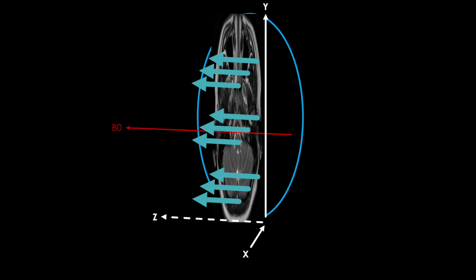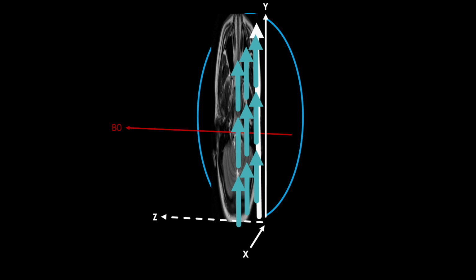Let's quickly return to the visual from the previous lecture and examine this further. Here we have all of our little magnets aligned with the z-axis, the B0 magnetic field, to start. We apply our first RF pulse, in this case let's pick 90 degrees, and it flips the net magnetizations from each voxel into the XY plane, perfectly aligned with the plane since we chose 90 degrees, and with their overall orientation shown by the white arrow.